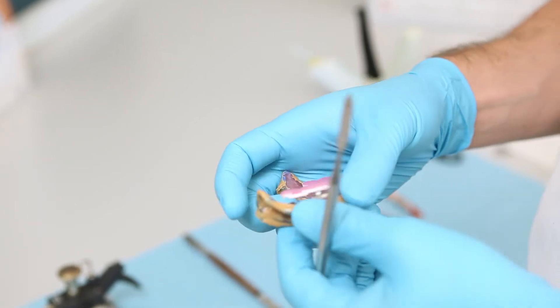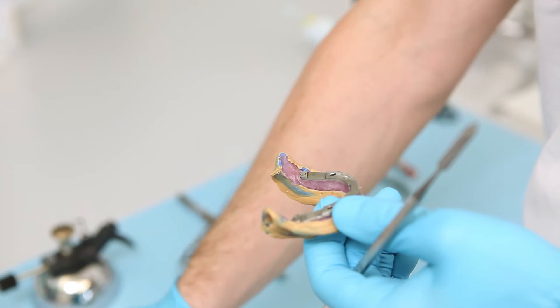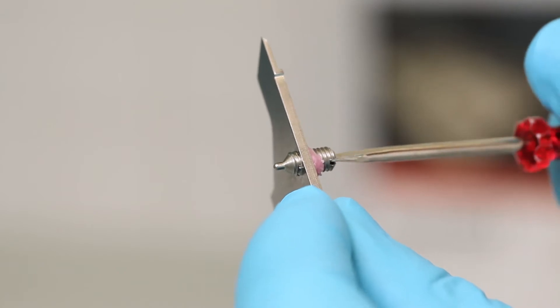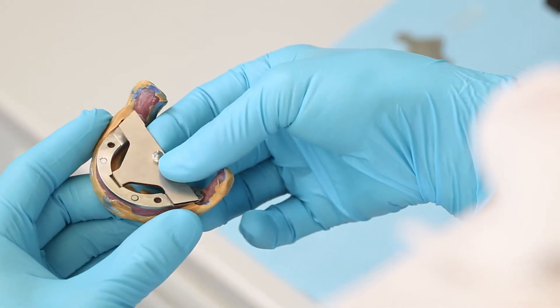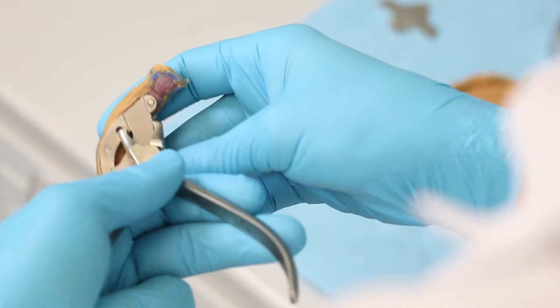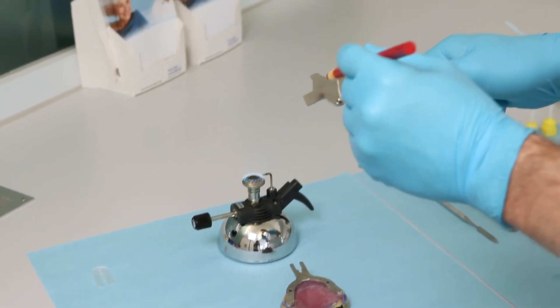To prepare for the registration, remove the white bite plates. Adjust the vertical dimensions if necessary by rotating the screw — one rotation corresponds to one millimetre. Secure the adjusted screw with some wax. Attach the registration plate with the stylus to the lower impression using forceps. Proceed in the same way in the upper jaw.